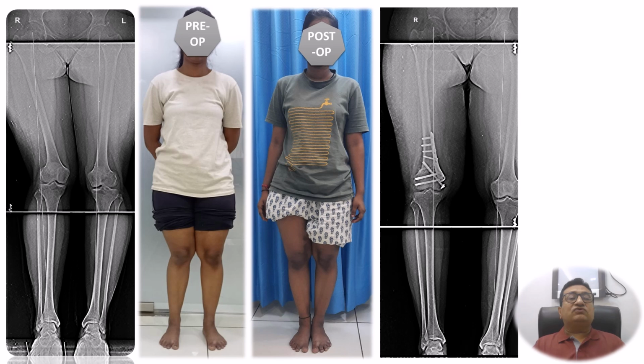If we look at the clinical picture, the valgus deformity is corrected well, and both limbs look equal now after surgery. And if we look at the X-ray, the weight bearing axis, which was passing far away from the middle of the knee joint, now passes through the medial compartment.